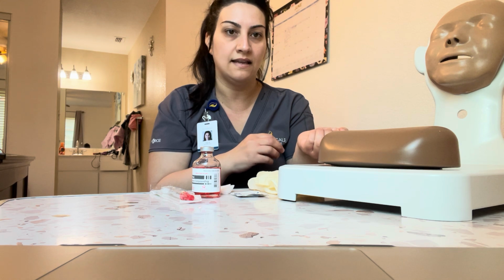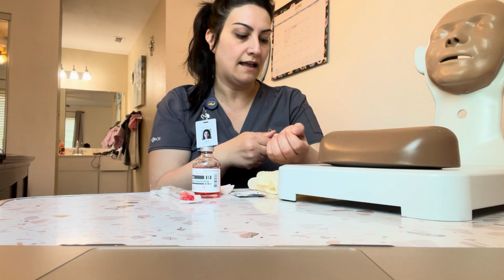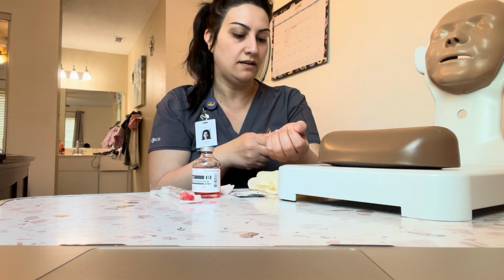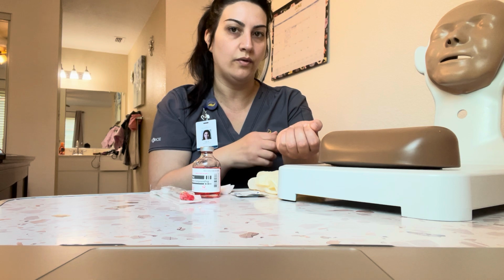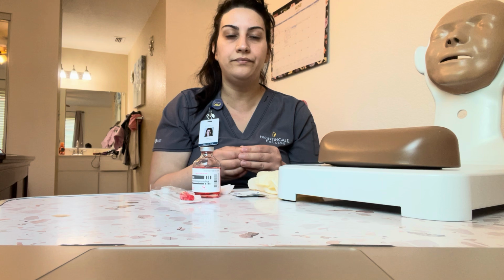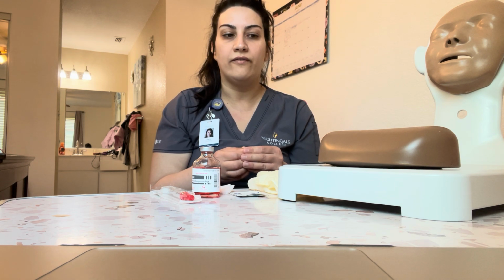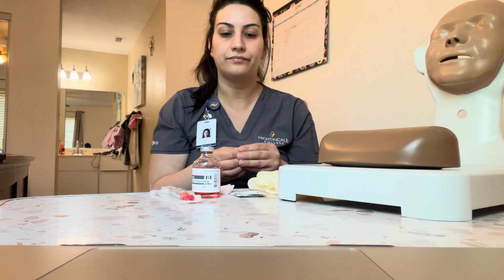It is a skin sensitivity test. Basically, we're going to inject that in your dermis, and we will go ahead and reassess that in 72 hours. The use of it is that it helps us know if you have any tuberculosis right now, or if you had it in the past.